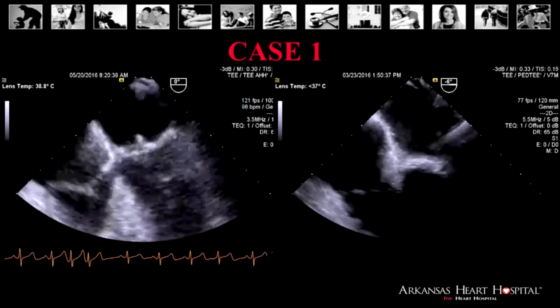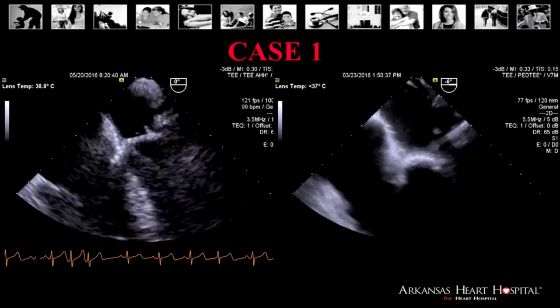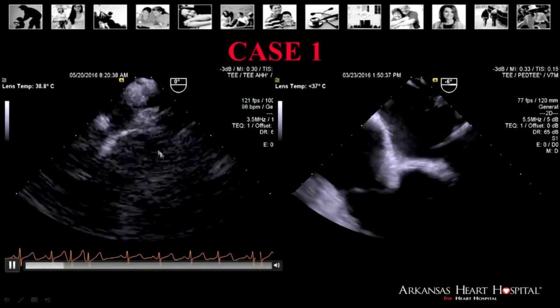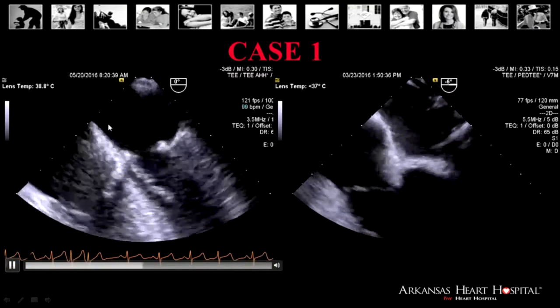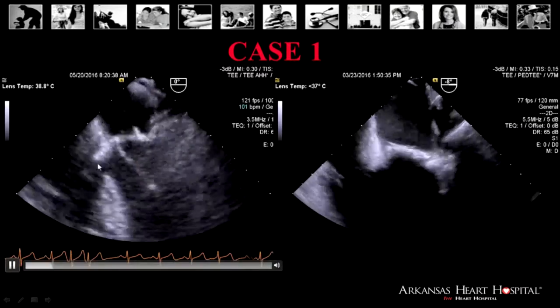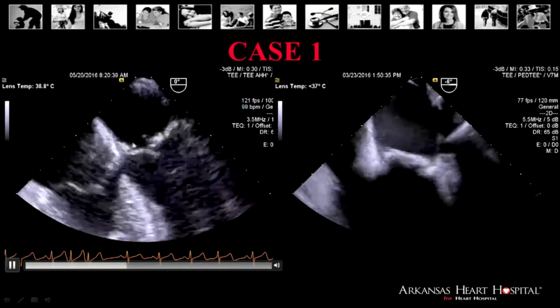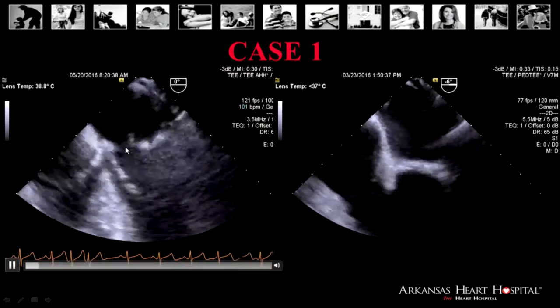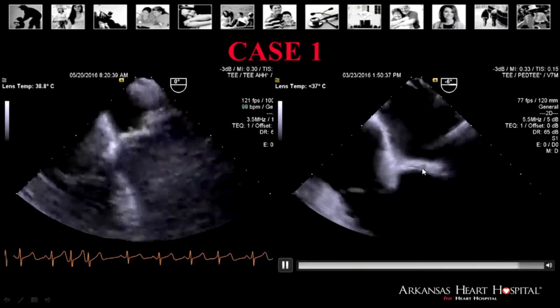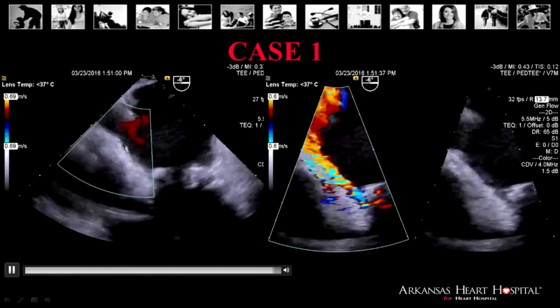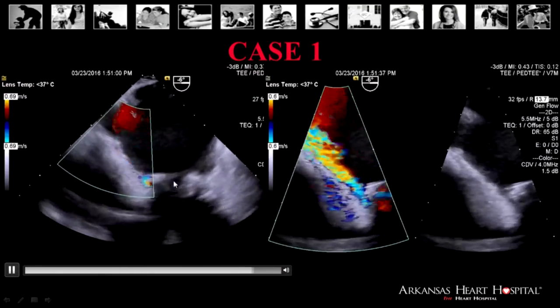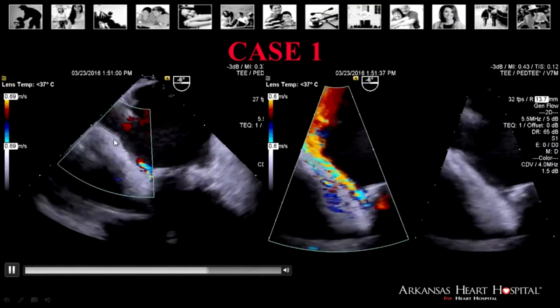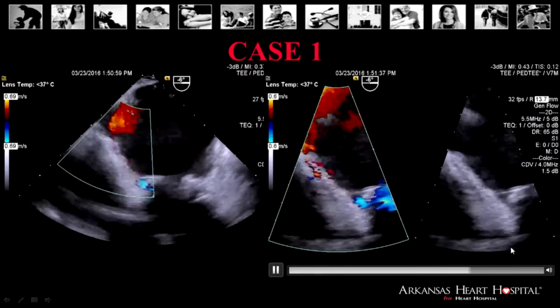On the left is a baseline showing what a normal TEE looks like — the top is the left atrium, left side and right side with right atrium and right ventricle. On the right side is the mitral apparatus. Our patient's image looks different: that is her mitral valve replacement and the ring around it. This is color Doppler — if there were a leak because of the valve itself, the jet would be coming through the bioprosthetic valve. Instead, we see the leak coming around the valve itself. By definition, that fits the criteria for paraprosthetic or paravalvular leak.